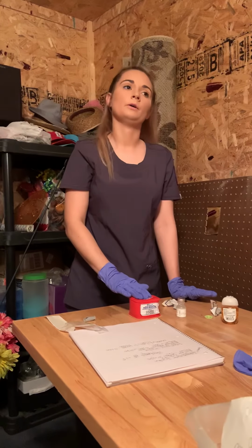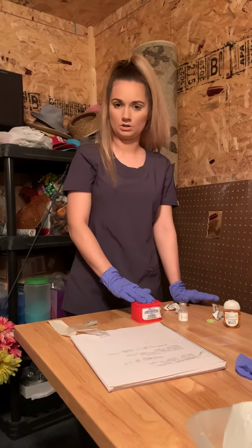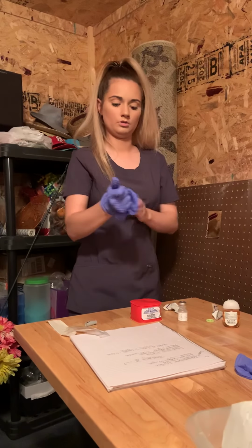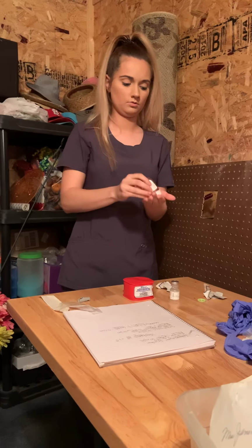Do not put any pressure on. If you do, just make sure it's real gentle. Do not massage the skin either. Apply bandage if necessary. You would take your gloves off and perform hand hygiene.